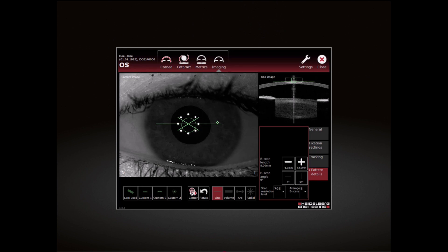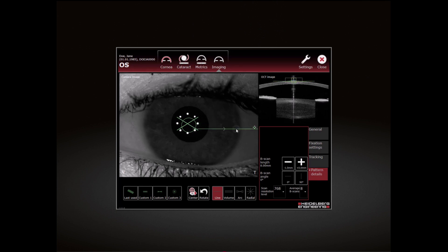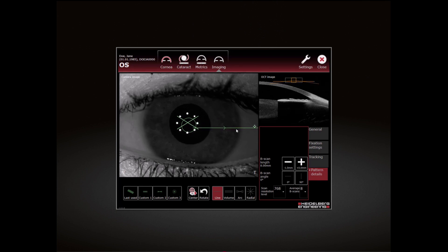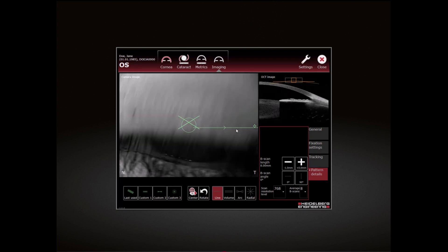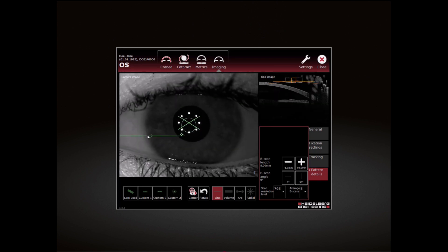To define the desired scan position on the camera image, tap the position where the center of the scan pattern should be placed.